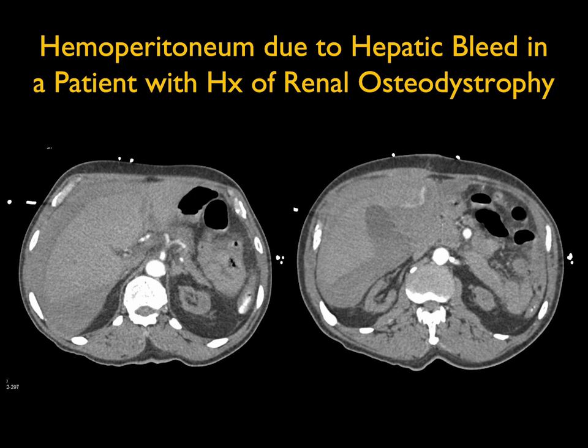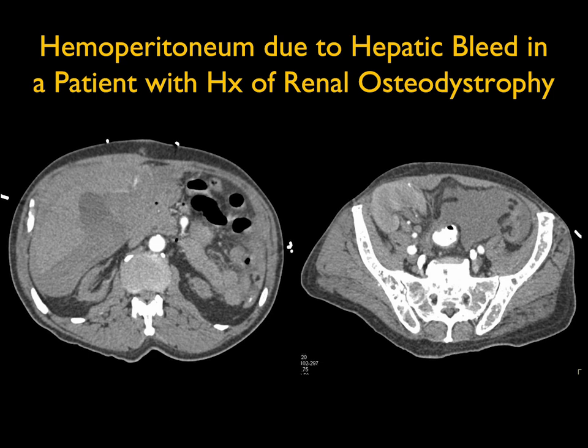Case 10: a large hemoperitoneum with active bleeding anteriorly off the left lobe of the liver. The first questions I would ask in this patient with end-stage renal disease: did the patient have a recent biopsy, or did the patient have trauma? You can see renal osteodystrophy and a transplant kidney functioning well in the right lower quadrant. When I see a spontaneous bleed with active bleeding I look carefully at the liver for a tumor — tumors that can bleed include hepatoma, hemangioma theoretically, and hepatic adenoma, which is always at the top of the list.